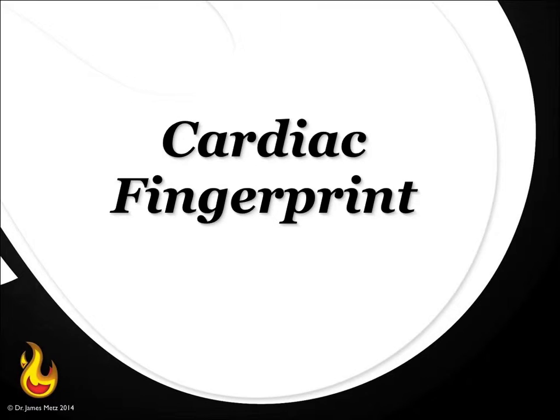One thing about the pulse oximeter: if you turn it on while they're in the office and record about 10 minutes, that gives a pretty good cardiac fingerprint. So this can't be moved on to somebody else, and you know that the person you gave it to got the oximeter.